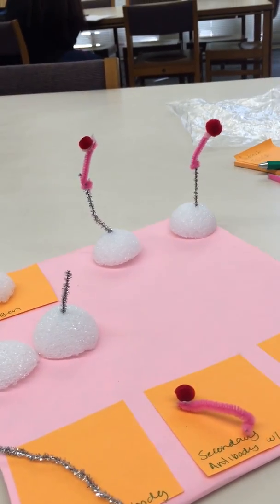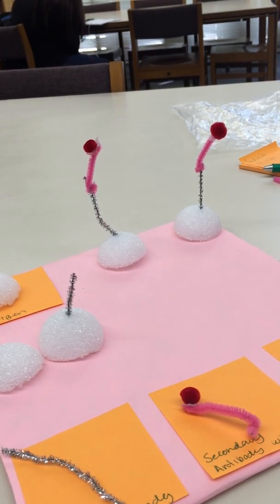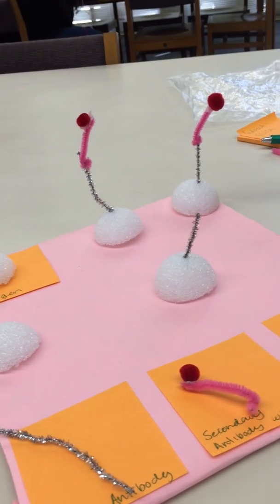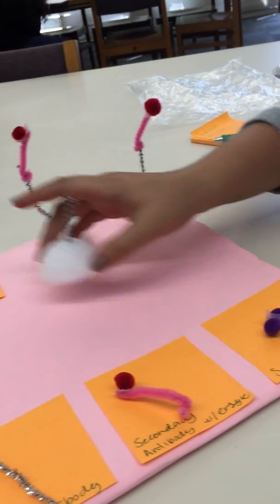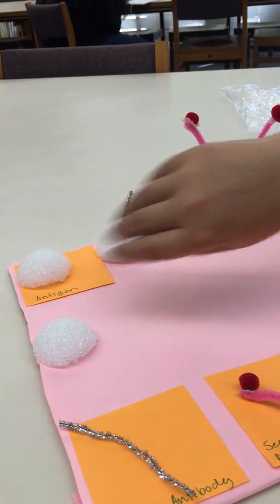These tests are important to note that because you can test for different antigens in them, if you get a bunch of antibodies sticking to them, you can test for a lot. You can see that there's a lot of those types of antigens. So you could say that, oh, there's a whole lot of bacteria in their blood, so they're probably really sick.